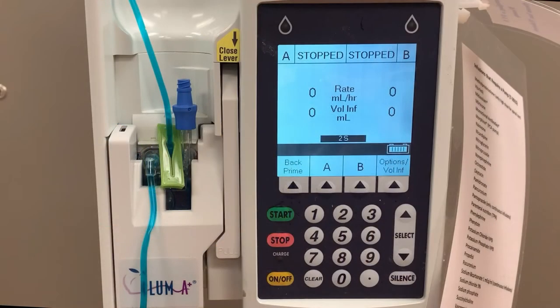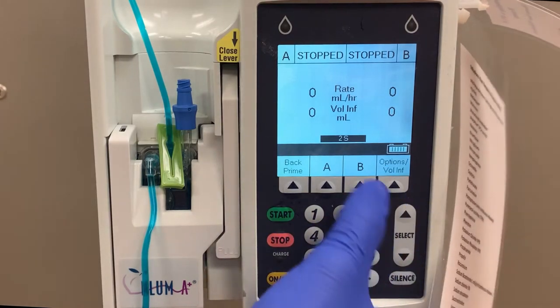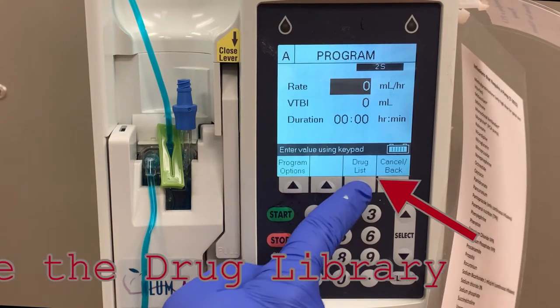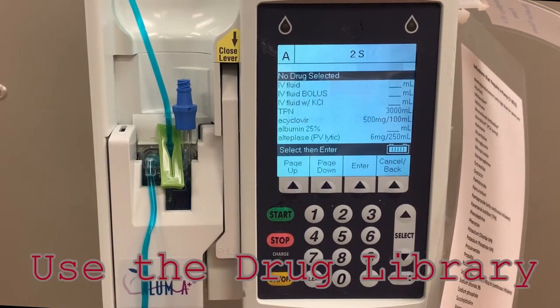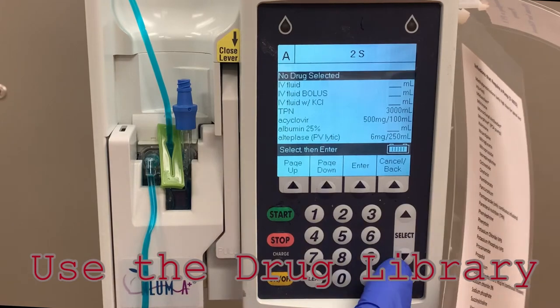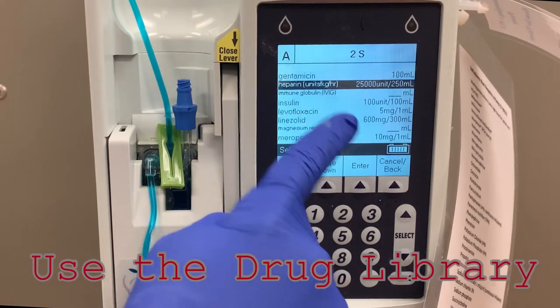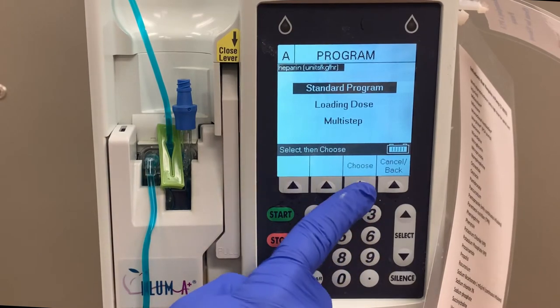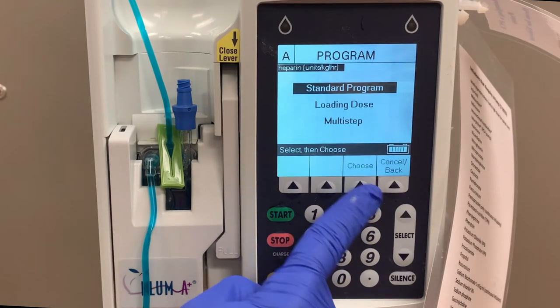When the cassette test is successful, you will be able to program the pump. Press the A button and you will be taken to the screen to program for the primary line. Now press the drug list button and you will be taken to a list of all the medications available on that unit. For this example, heparin will be selected. For most medications, you will be programming using the standard program.